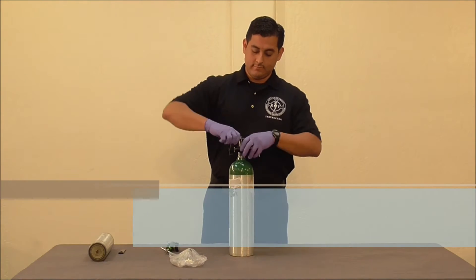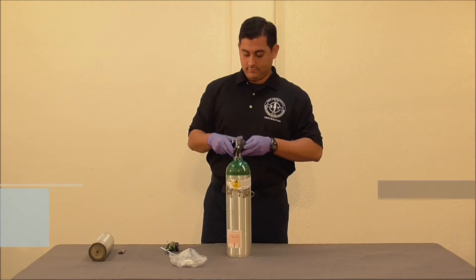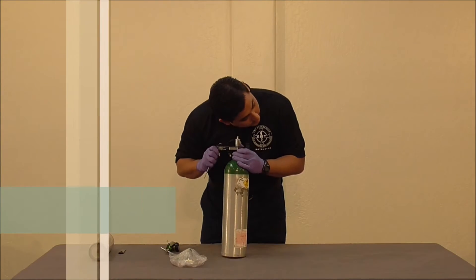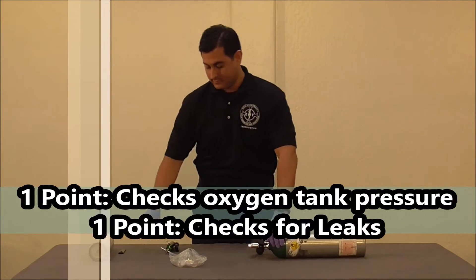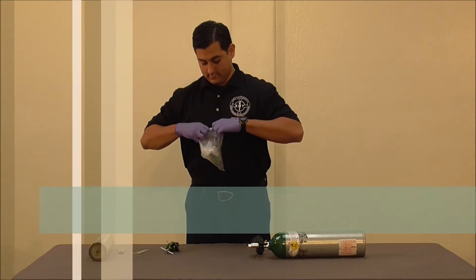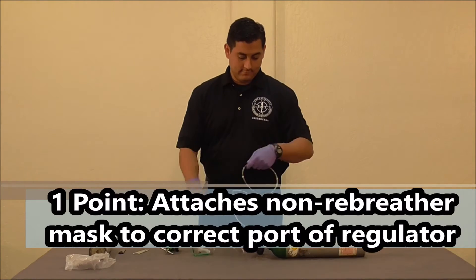Be sure to open the oxygen tank valve. Check the oxygen tank pressure, and also check for leaks. Attach the non-rebreather mask to the correct port of the regulator.